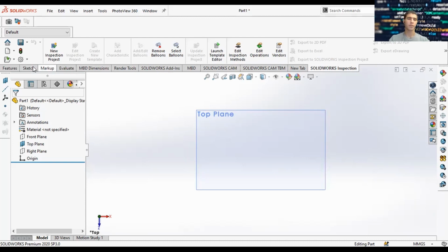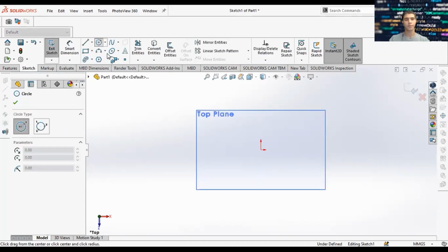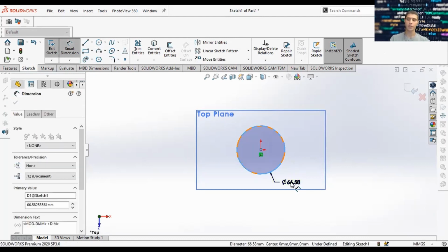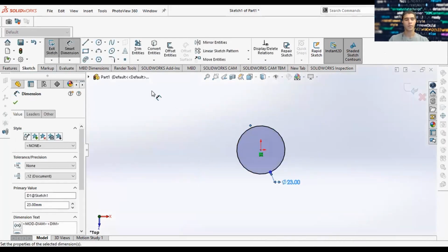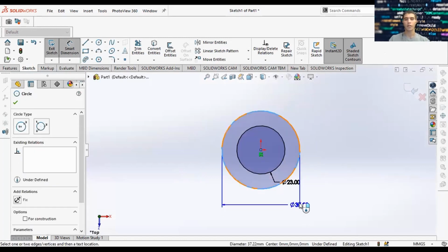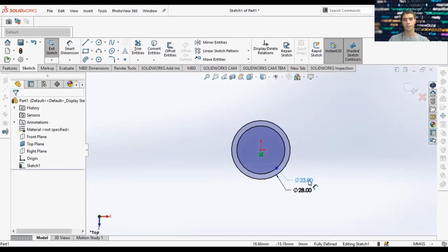And we begin with sketching on the top plane. We'll sketch a circle. And the dimensions for this, if you remember on the PowerPoint, it was 23 millimeters. Then there was a second one for the outer diameter of the annulus, or the cuff. So the cuff will be the part that attaches to the native tissue. And so we have 23, 28.